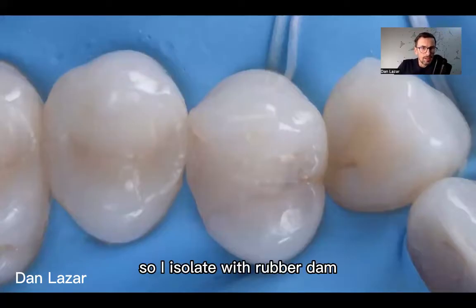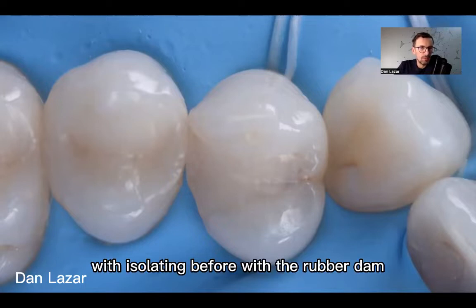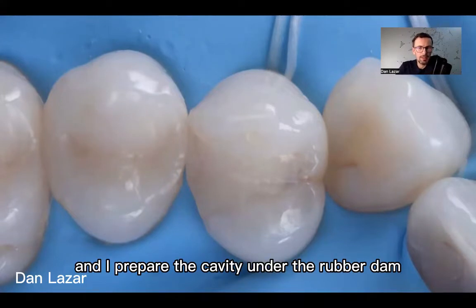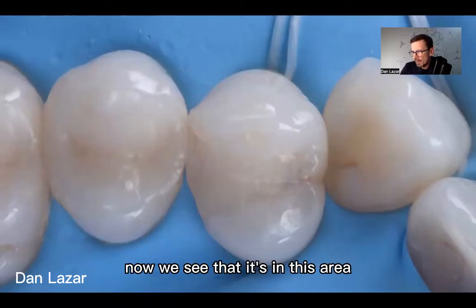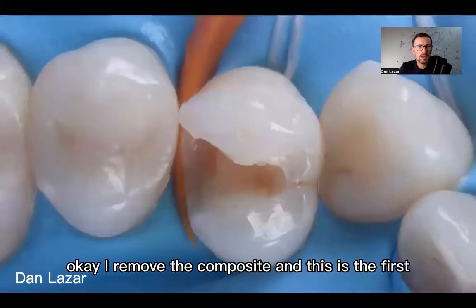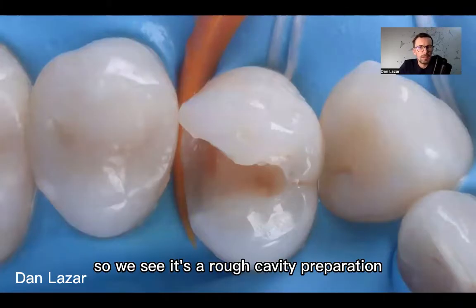I isolate with rubber dam. I always start the class two by isolating first with the rubber dam and I prepare the cavity under the rubber dam. We can see the composite better now — we see it's in this area. I remove the composite and this is the first stage. We can see it's a rough cavity preparation.